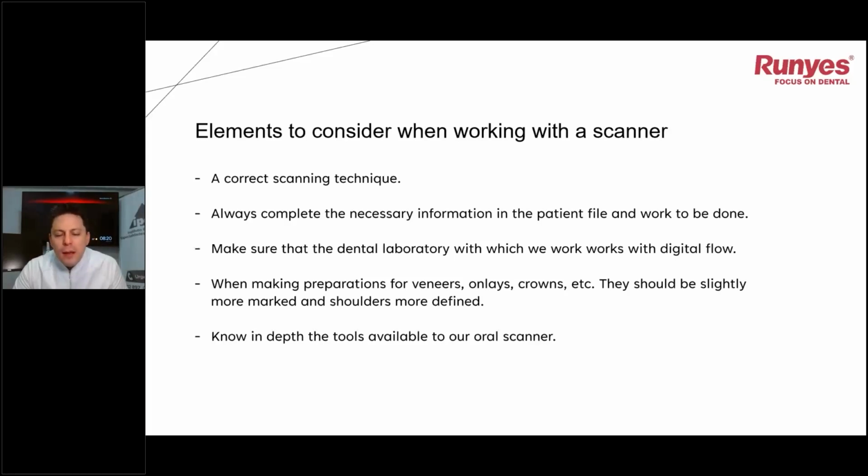It's difficult sometimes, but it will be ideal with no blood, because, unlike silicone, our scanner takes the picture of the blood and mistakes it for part of the preparation. Sometimes when we scan, we see little drops of blood, or we can see that it wasn't accurate, because the scanner takes a picture.